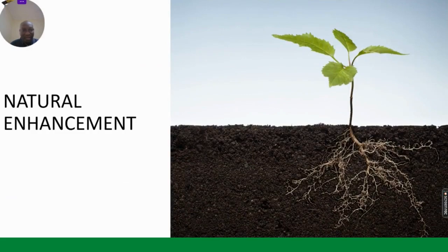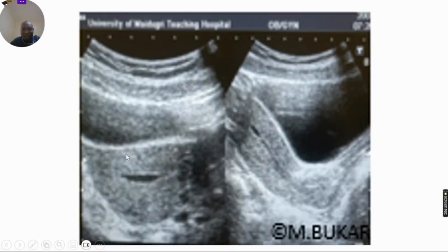Now let's look at natural enhancements — natural enhancements by blood within the endometrial cavity. This patient came while she was menstruating, so this is a natural enhancement. You can see the anterior and posterior lip of the endometrium and the lateral lip, and you can see clearly that there is nothing in the endometrial cavity.